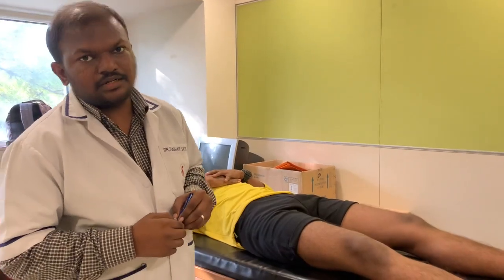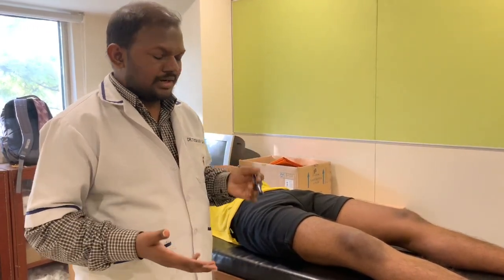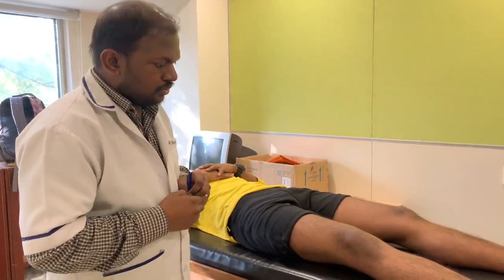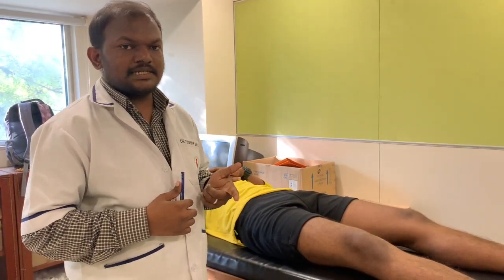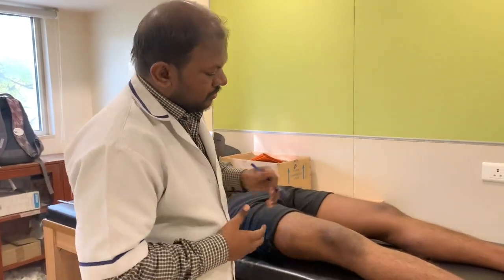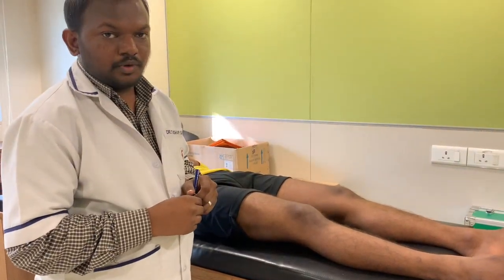Now we will start to assess the knee range of motion for the right side of this particular subject. To keep a goniometer, as I said previously, we need three major important points, that is fulcrum, stabilizing arm, and movable arm. To mark the point where you will keep the fulcrum, for the knee joint, it is the lateral epicondyle.